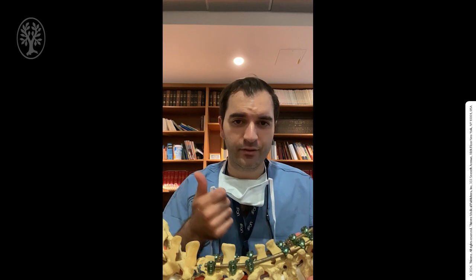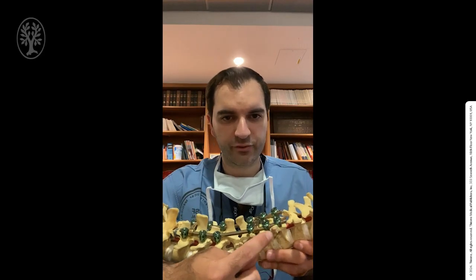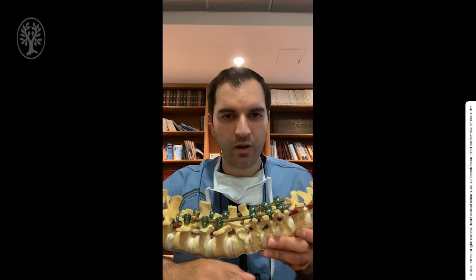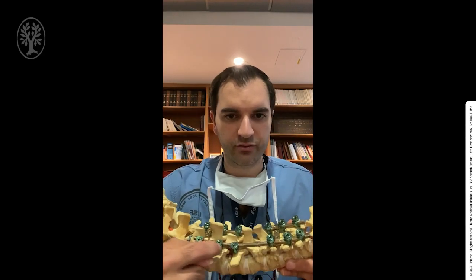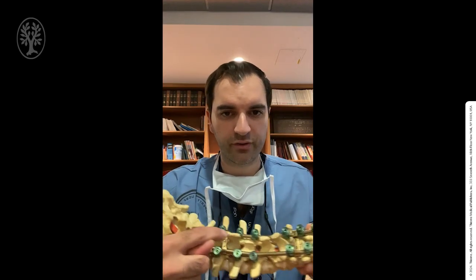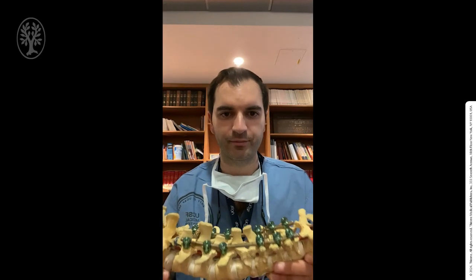I have brought with me a model to demonstrate some of the commonly used components. They can be divided into three classes in general. There are anchors, there are longitudinal connectors, and there are cross connectors. In this case, in the lumbar spine, we have anchors, which are the green screws that were placed into the pedicles. These are connected to each other with a longitudinal connector. In this case, it's a rod. And the two rods are connected to each other with cross connectors, which increase the overall stability.